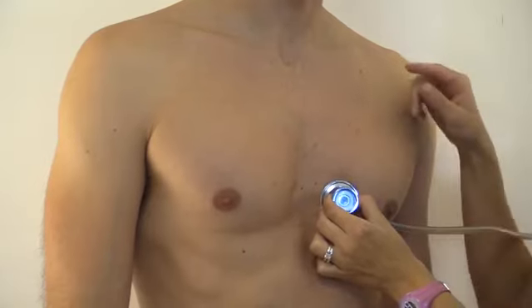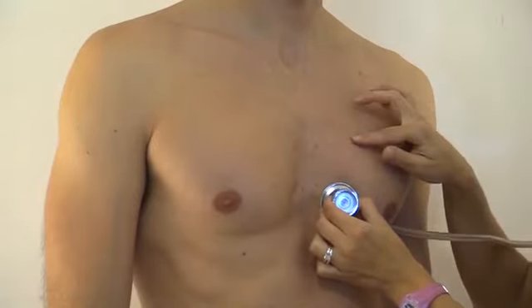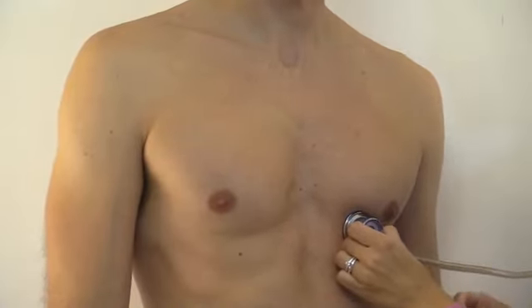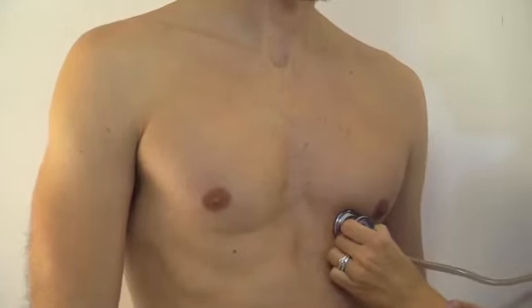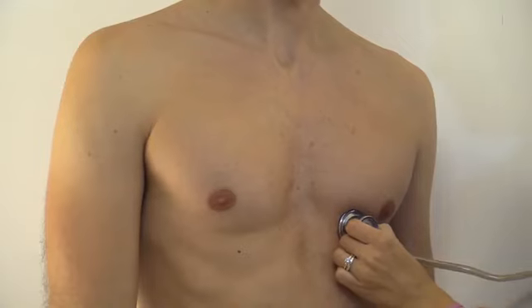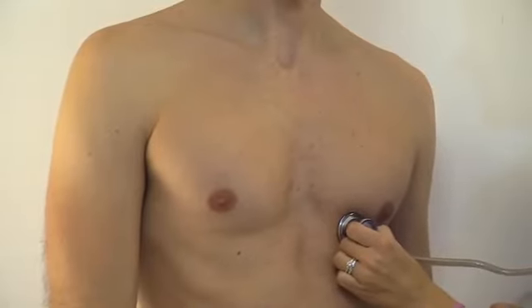Then we go to the fifth intercostal space, mid-clavicular line, and listen to the mitral valve. Again, S1 is going to be loudest here. There's something special about this site. This is the point of maximal impulse, where you listen for the apical pulse. We're going to count it for 1 full minute. A normal apical pulse in an adult should be 60 to 100 beats per minute, and his apical pulse was 63.